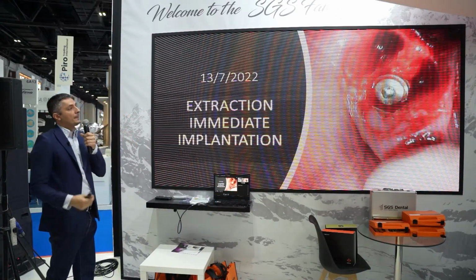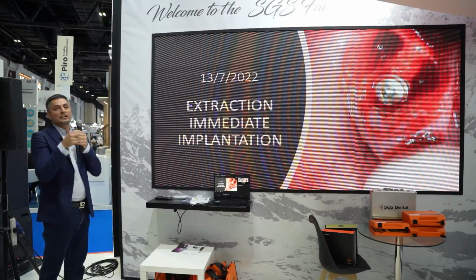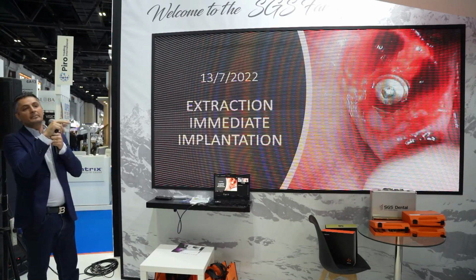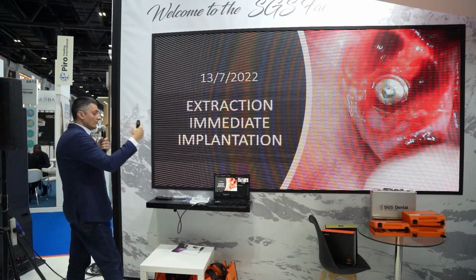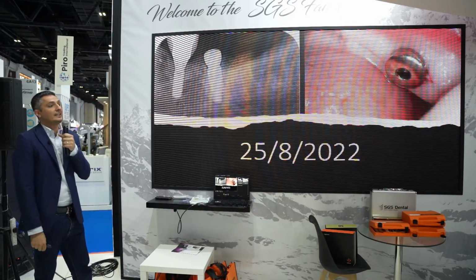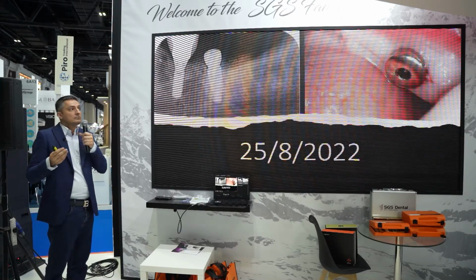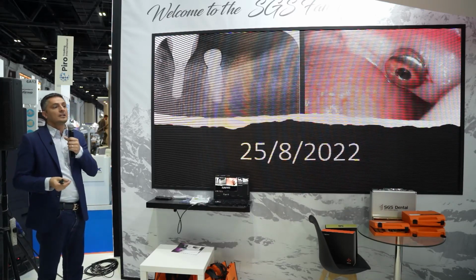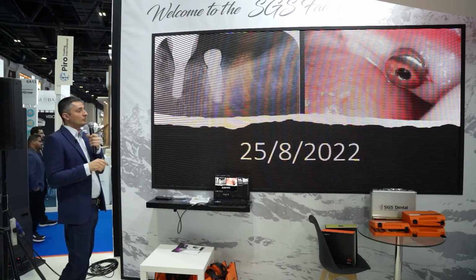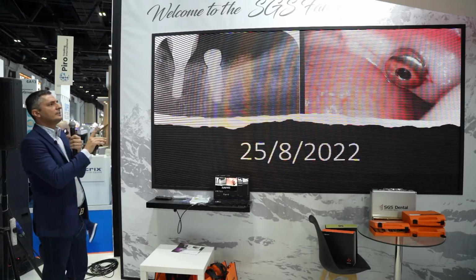Another case, it was a lower molar. I extracted the molar and put a P5D. For sure, I grafted with the membrane and everything. But we all know in our clinic, some patient came very early, barely 1 month and a half. I need to load it. We can't load this implant. I need to load this implant. I told her, okay, let's do it. So what I did, the second stage after 1 month, 12 days.